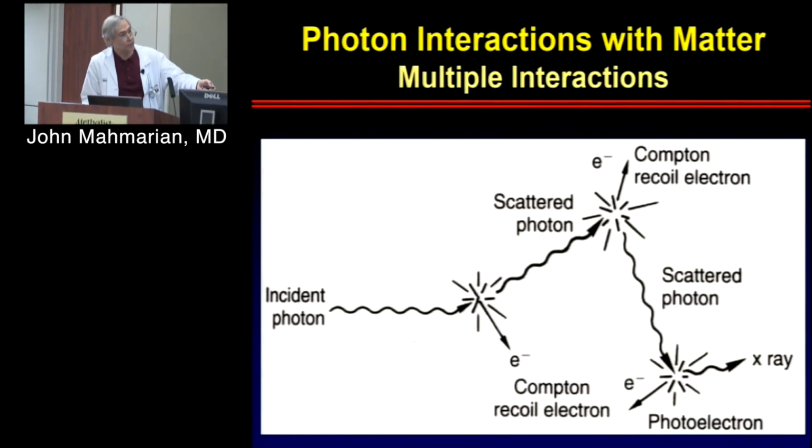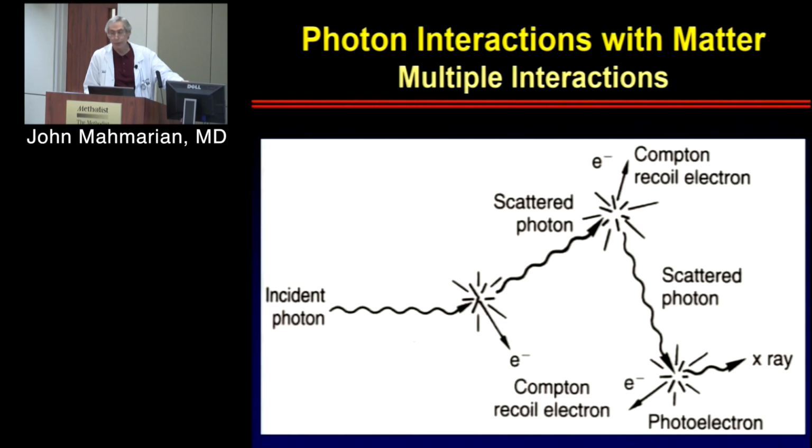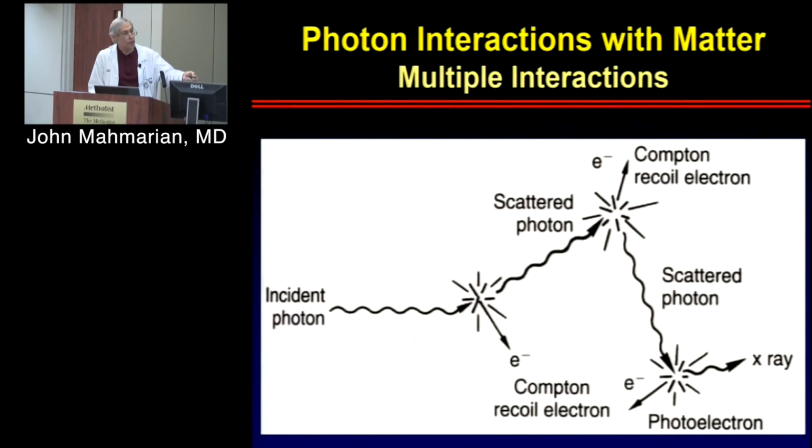So you have the incident photon here, and you have the actual detection here, and you can see the distance, and that's why that really hampers the spatial resolution. Okay, so that's something to keep in mind in terms of the radiopharmaceuticals and this whole terrible concept of Compton scattering.